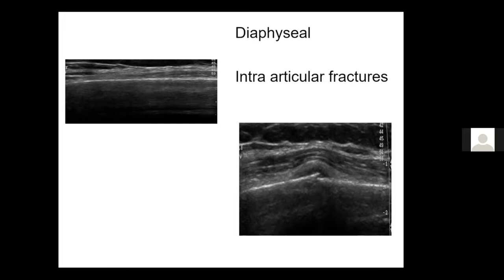But when the bone becomes fractured, as in this case, we can see there's a cortical break. And then this is really interesting — it's fluid. It's blood in a subperiosteal position. This is the periosteum. It's the presence of fluid, which ultrasound is excellent at demonstrating, that gives us the diagnosis.